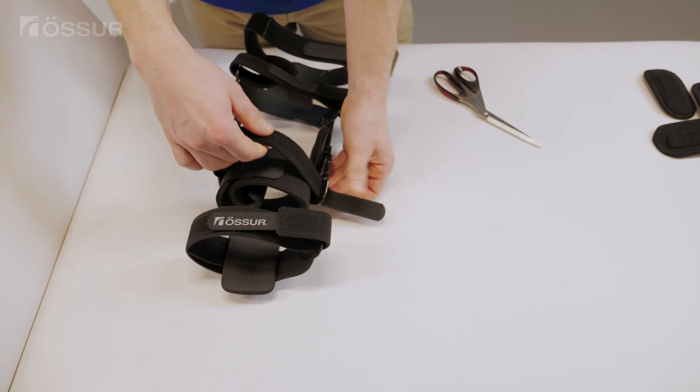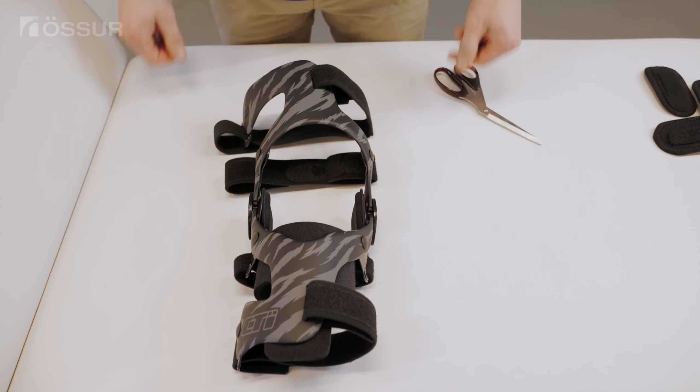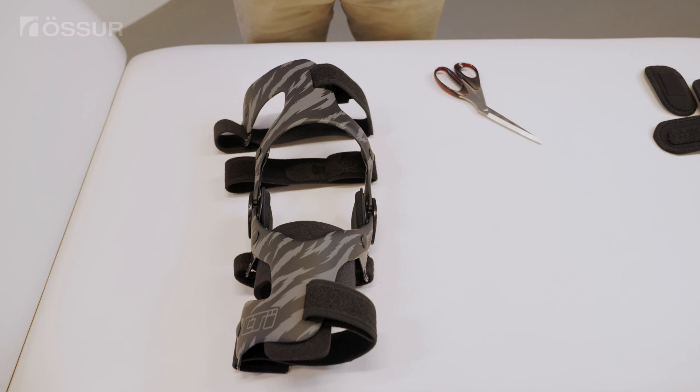Apply the brace to your leg. Fasten the AMS wrap first, then fasten strap number one on top of the wrap. Fasten the remaining straps in the correct order.